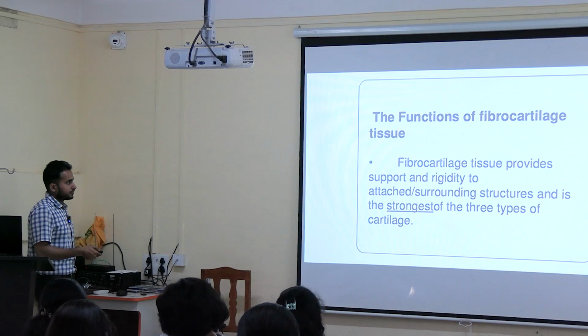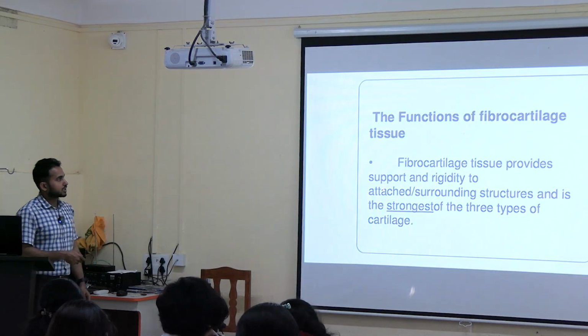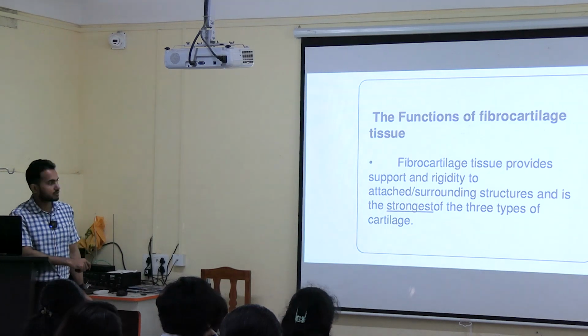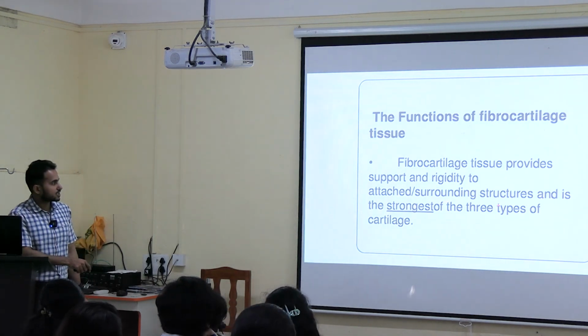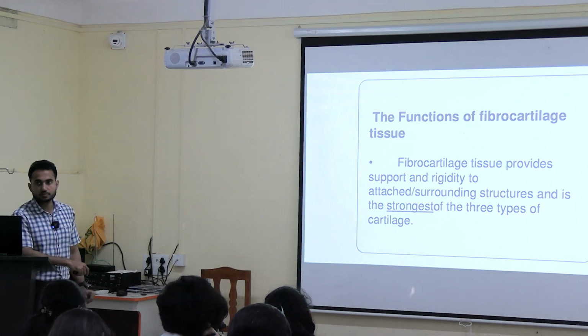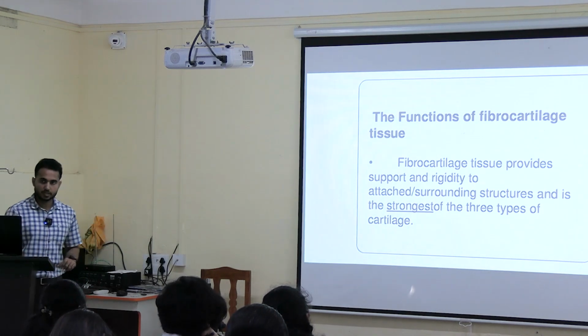Now what is the function of fibrocartilage? Fibrocartilage provides support and rigidity. It will provide support as well as rigidity to the surrounding structure, and it is the strongest of all the types of cartilages because it has thick bundles of collagen fibers.